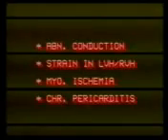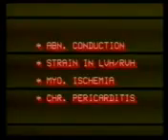T-wave inversions. A T-wave inversion may occur in four conditions: abnormal ventricular conduction, strain pattern in ventricular hypertrophy, myocardial ischemia, and generalized T-wave inversions in chronic pericarditis. So if ventricular conduction is normal, that is the QRS complex is normal, and if there is no hypertrophy of ventricles with strain, then T-wave inversion strongly points to myocardial ischemia.